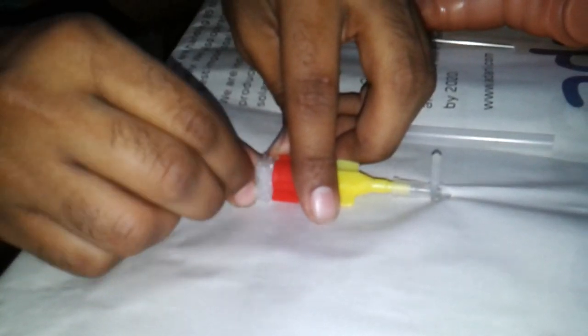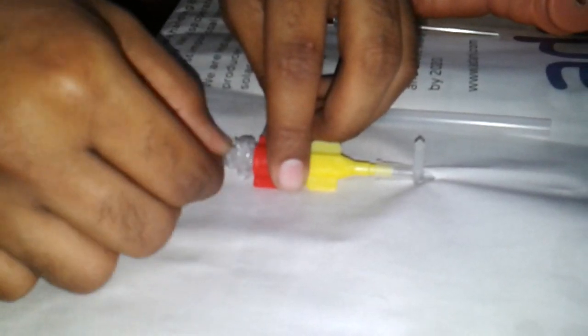I'll keep on pushing the wire inside. Again I will push it inside and pull back the plastic paper. Now I have pushed it all the way. We have to twist this thing and the wire will stay here. We have twisted the red thing so it has separated, and we remove it with the plastic.